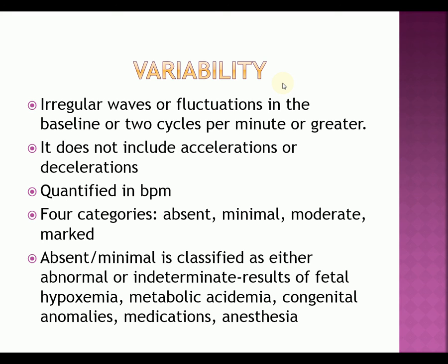Of course, your moderate variability is the kind that you like the best. It's considered normal. It's highly predictive of a normal fetal acid base, as we've been mentioning, and the absence of fetal metabolic acidemia.